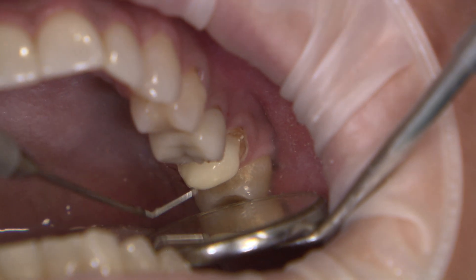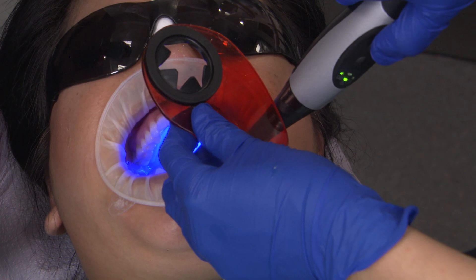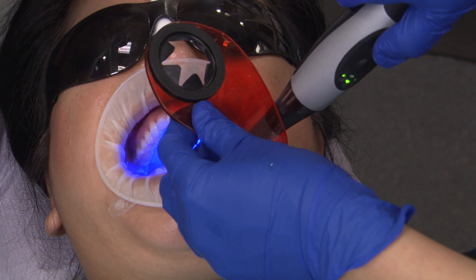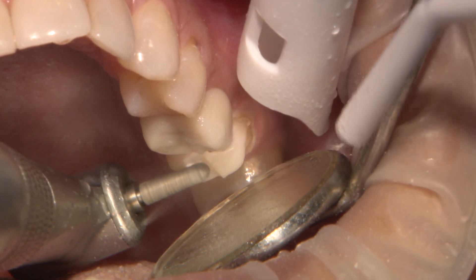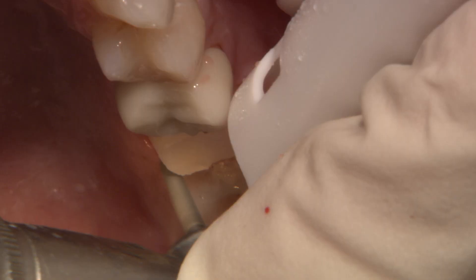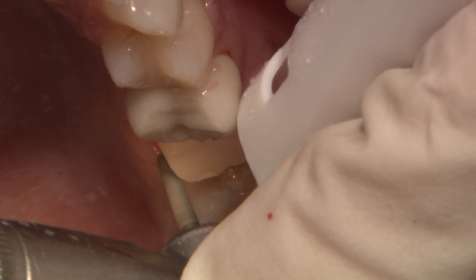An ideal CAD-CAM crown preparation requires 1.5 to 2 mm of occlusal reduction and 1.5 mm buccal-axial wall reduction. I use a long-tapered round-end diamond burr to create a deep chamfer for sharp, cavo-surface margins. Whether you are taking a conventional impression or a digital impression, it is important to visualize the prepared margin.